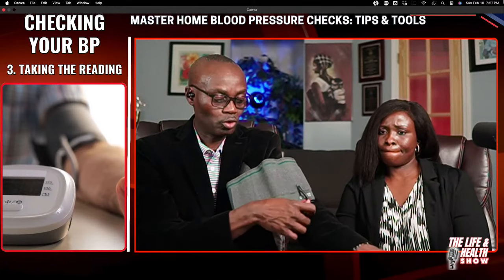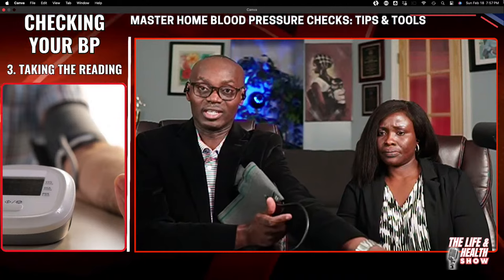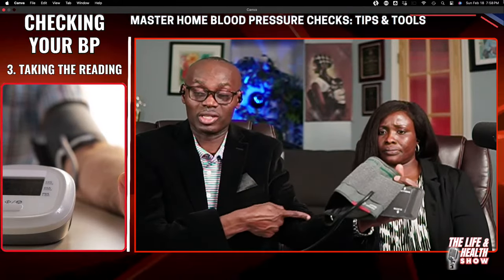So taking the reading now, this person that we are showing has placed it somewhat perfectly. The only thing is the tubing is not in the middle of the arm. It should be in the center of the arm, like I showed you. The tubing has to come right in the center, not on the side like this person's arm is showing. This one is almost to the side, but it's close enough, so we get the idea. But as far as the placement of the end of the cuff, it's right on point at the joint of the elbow. That is what we want, right?